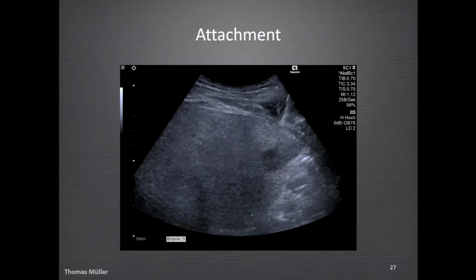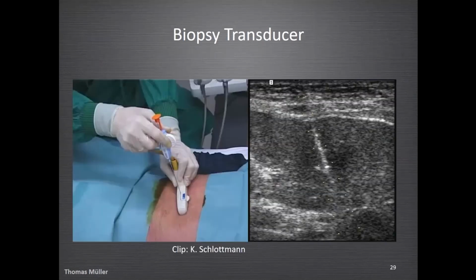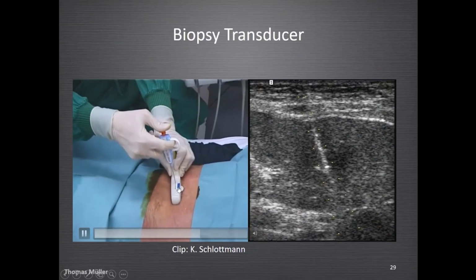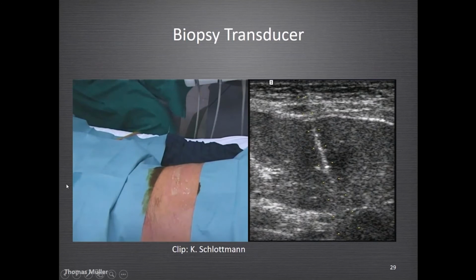And even more sophisticated are dedicated biopsy transducers, which have a central perforation for your needle. They are very expensive. They have to be sterilized after each use, and of course they're very convenient, but they are expensive, and sterilization is time and money consuming. If you have it, of course, you can use it very well, and you have a good needle control. Here you can see the needle placement, bam, biopsy is taken and finished. Very fast access, but now the transducer has to be sterilized.